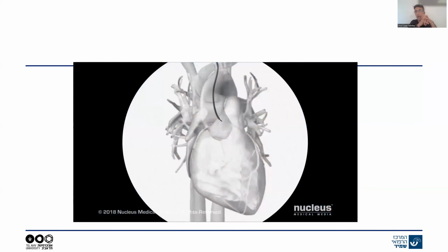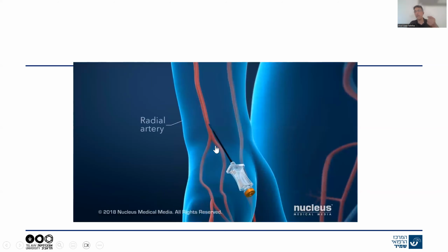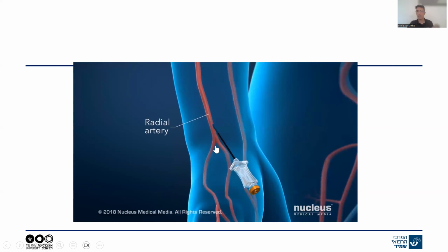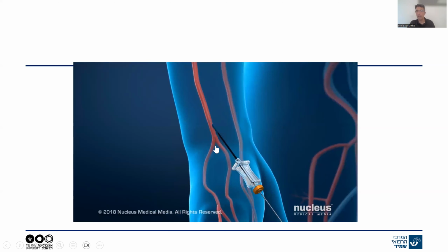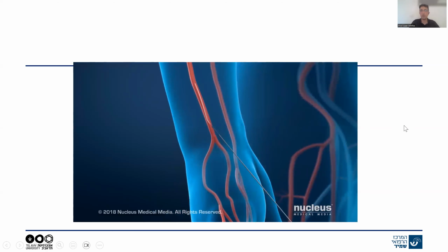And when we do our X-ray, as you can see here, this is just an animation. But if we were able to get our catheter inside the vessel, we can inject dye. Once dye is injected, with the pumping of the heart, it is diluted again by blood. But as you can see, there's a blockage here. So going back from the wrist all the way up to the heart allows us to cannulate, to put a catheter at the origin of the vessel. And we need to use X-rays and catheters to go all the way up and demonstrate that.